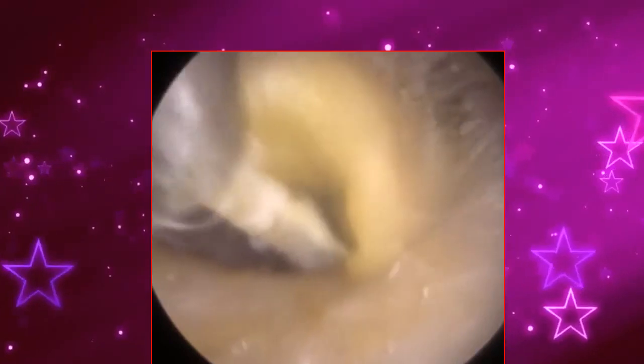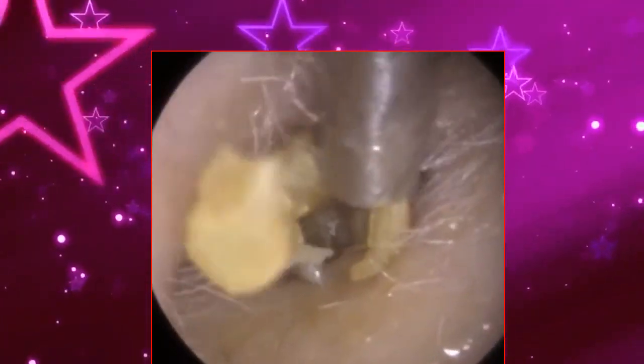The patient is really still, which always helps. So I'm rocking the suction tube up and down. You can see bringing this plug near the entrance. You can see the skin ribbons, it's all coiled. Dead skin is very elastic. It's got this spongy texture like a coil because the ribbons coil around each other. That's why I referred to it like a rubber ball earlier. A plug of dead skin in your ear is almost like a rubber ball.